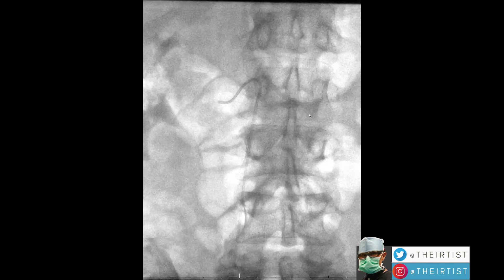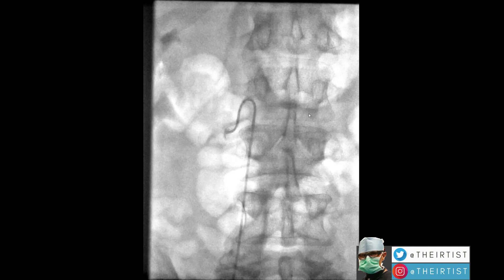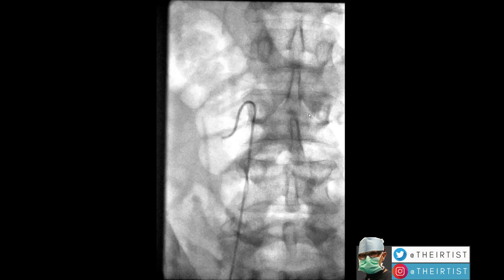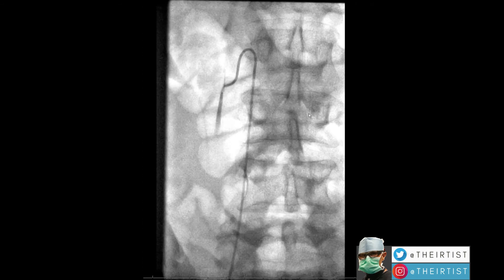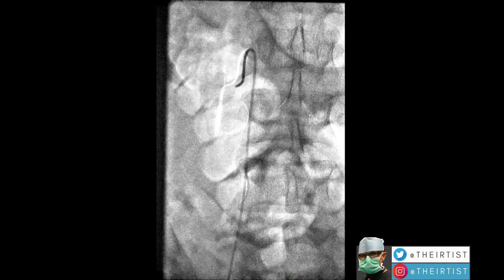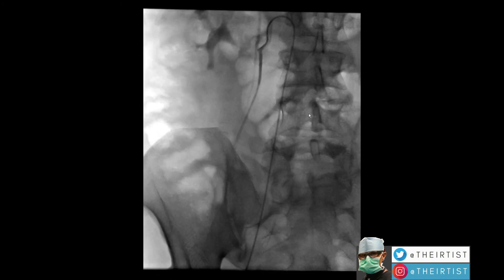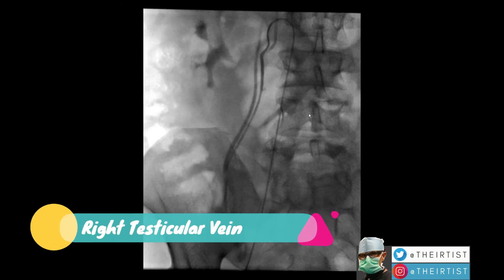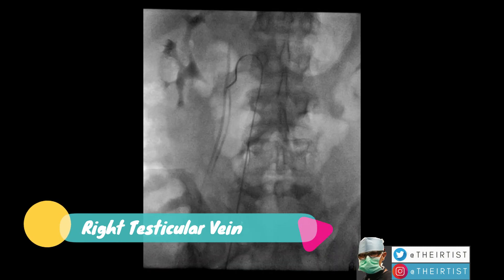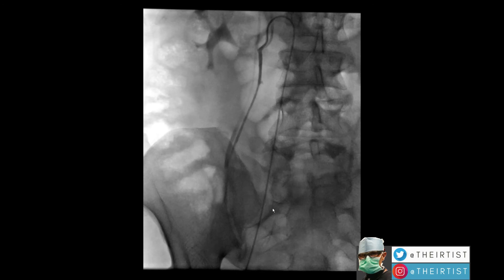Then we turn our attention to the right side. We use a different type of catheter to find the right spermatic vein. Once we find it by catheterizing and using a venogram technique, we see that the right spermatic vein is duplicated — there are two of them — and it goes all the way to the right testicle.